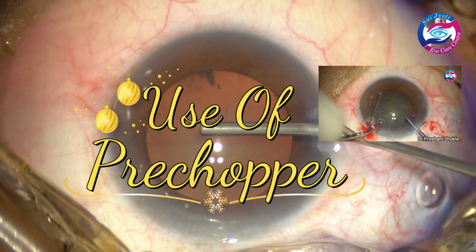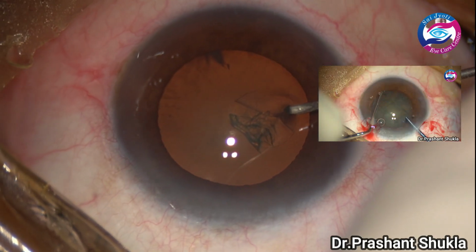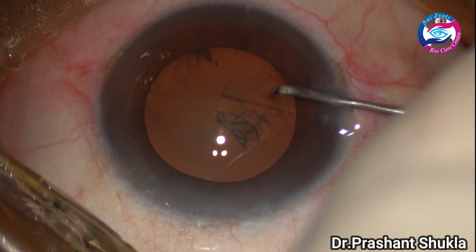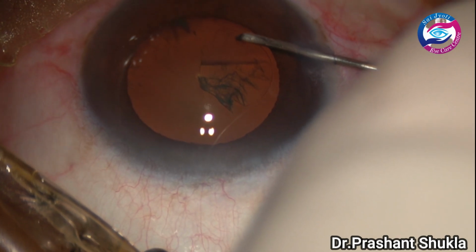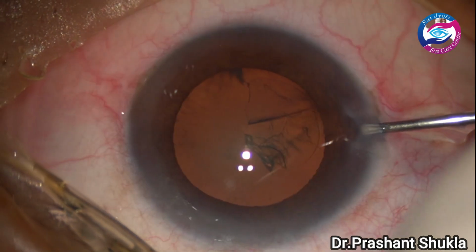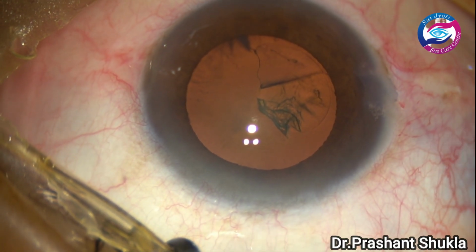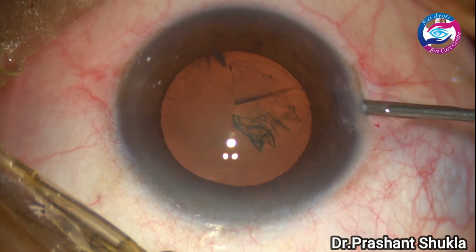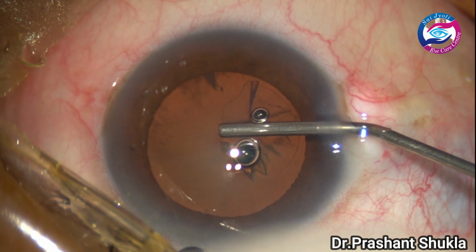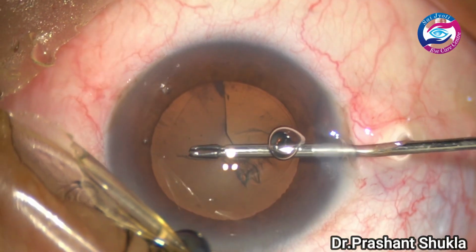Well, in this video I have tried a new technique, the use of a pre-chopper, and I am going to demonstrate it in this video. This is a relatively soft nucleus, and as we all know, soft nucleuses are sometimes a challenge to tackle because it's very difficult to hold them and they don't break up easily. So the use of a pre-chopper in these cases is a good idea.